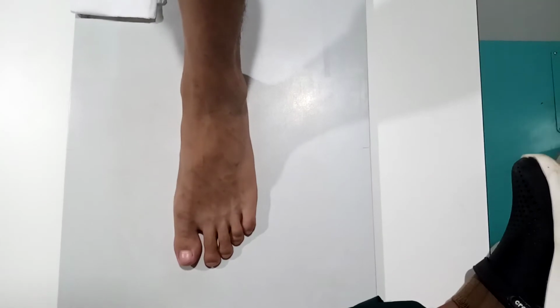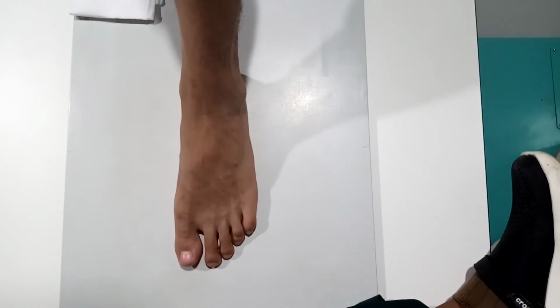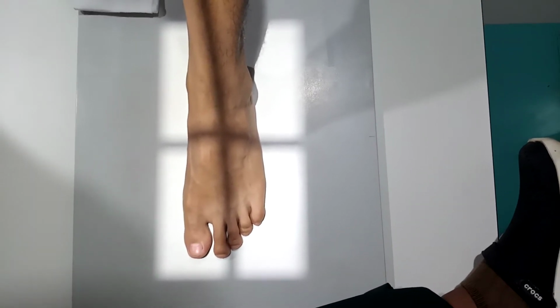This video will demonstrate the foot AP or AP axial projection, AP oblique, and lateral. First, we need to demonstrate the AP axial projection. The cassette that we're going to use is 24 by 30 cm or 10 by 12 inches. The orientation must be in a lengthwise position of the image receptor. No grid should be used in this procedure.